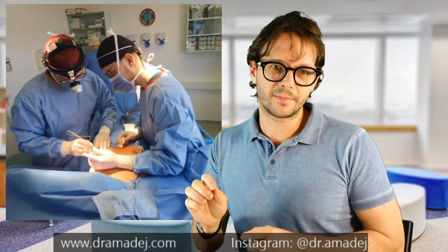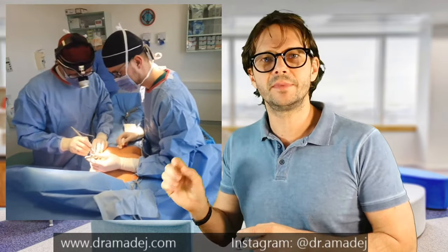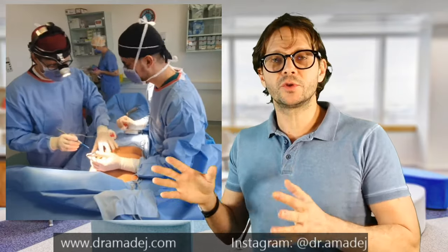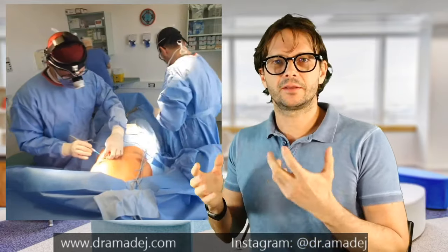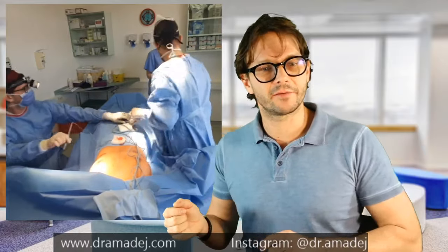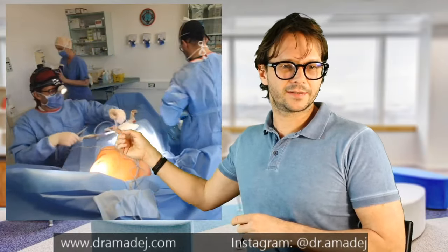This procedure is really bloodless — there is minimal loss of blood, practically nothing. It should not make any patient anemic, and complications in this way are extremely rare and almost never happen.